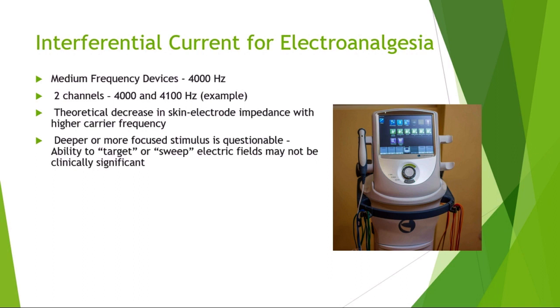It's been stated that there's a deeper or more focused stimulus, but that's not proven. It's questionable. The ability to target or sweep electrical fields may not be clinically significant. So even though that's stated as a reason to use IFC, the jury's out on whether or not that's true.